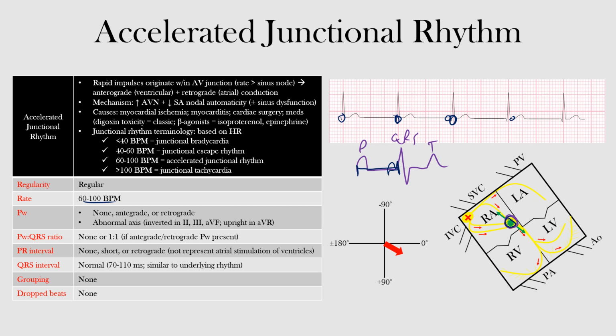So we're saying here, remember our P wave axis between 0 and positive 75. So this is the normal P wave axis. As things come from our sinus node and head in this direction, imagine this arrow representing that. Now our leads, remember, lead 2 sits at positive 60 degrees. Lead 3 is here. This would be lead AVF. You can imagine lead 1 at 0 degrees. AVR would be at this place.